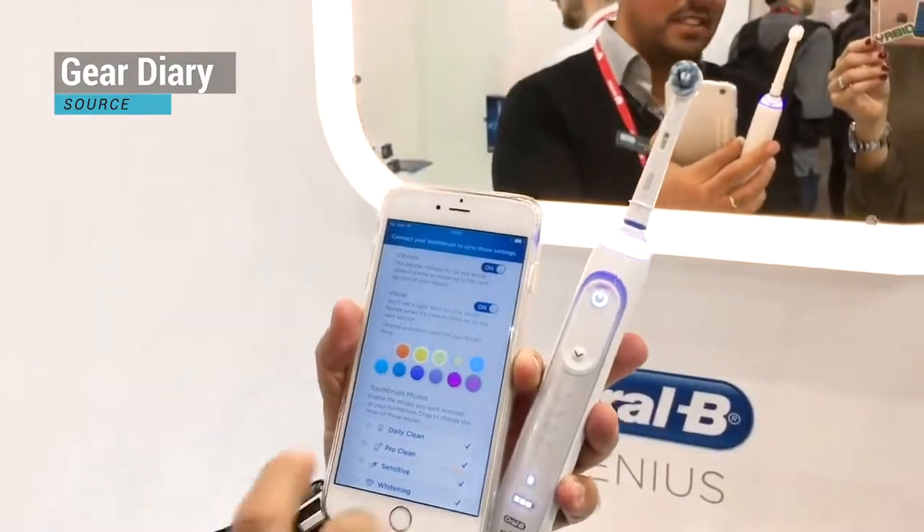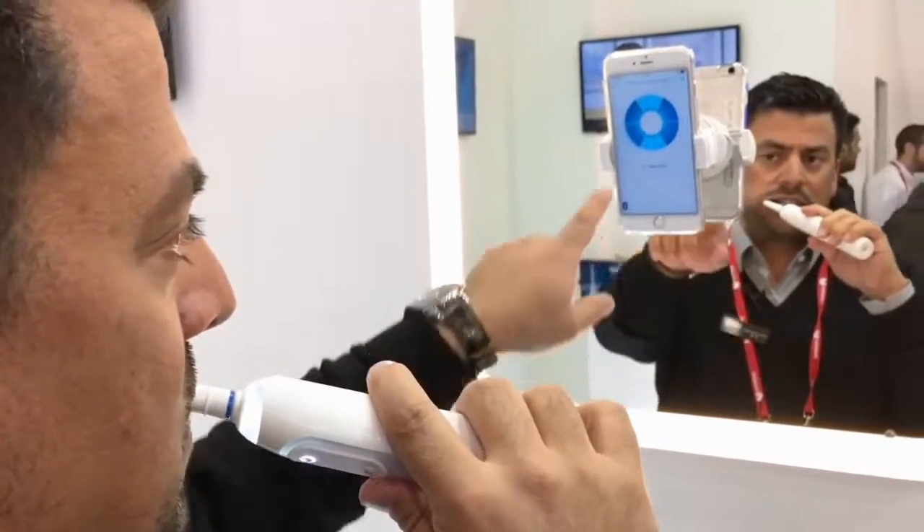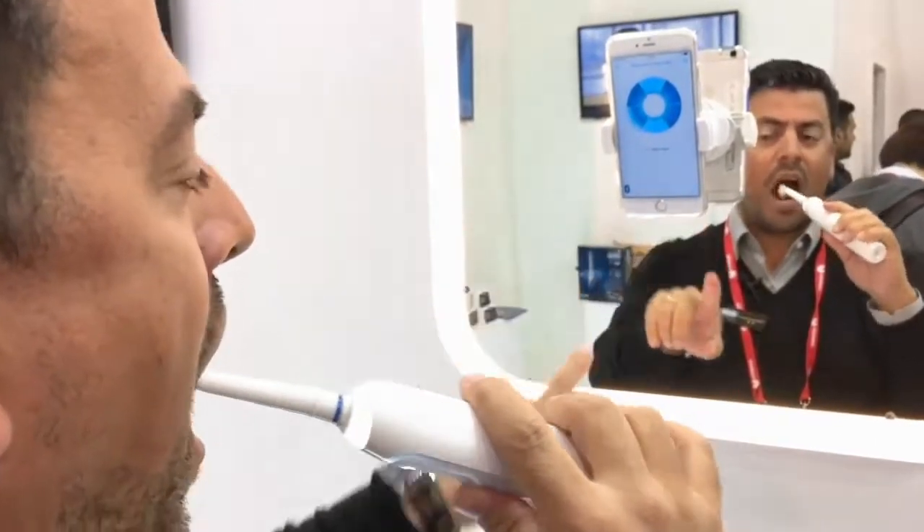It also has a really awesome app that you can connect to on your phone. The app actually shows you what surfaces you're missing on your teeth.